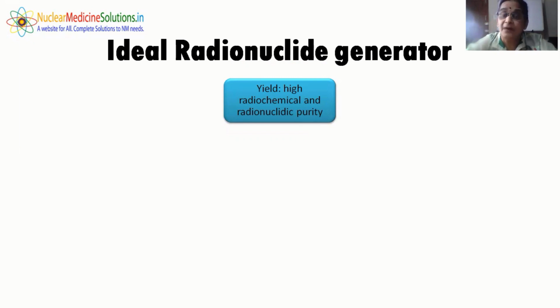It is pertechnetate in its +7 oxidation state. So the reduced hydrolyzed technetium becomes a radiochemical impurity, while radionuclide impurity is the parent radionuclide itself, which is present in the yield. As long as the parent radionuclide is in the generator, it is very precious radioactive material, while if it gets inside the yield, that becomes an impurity.